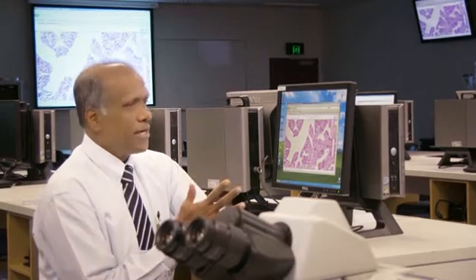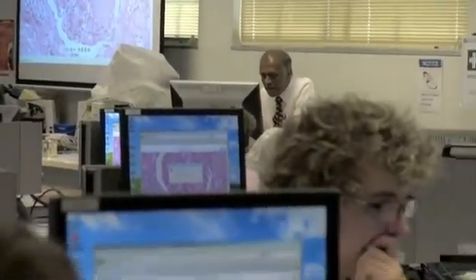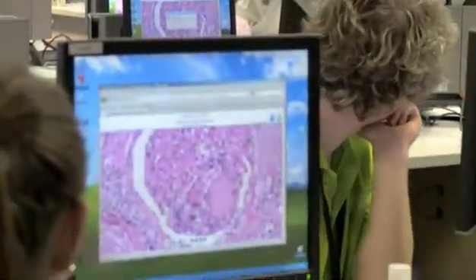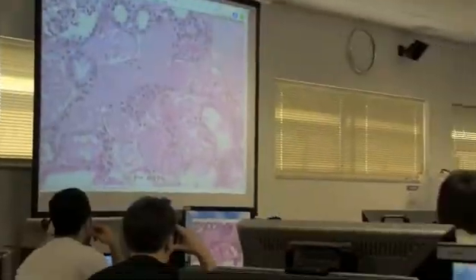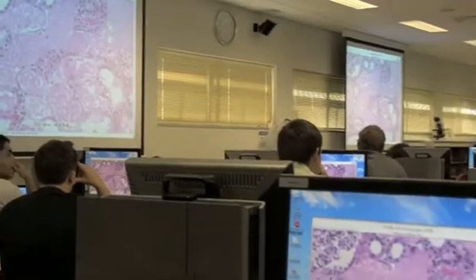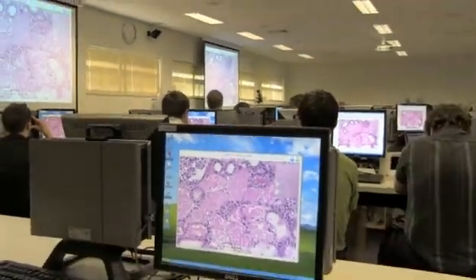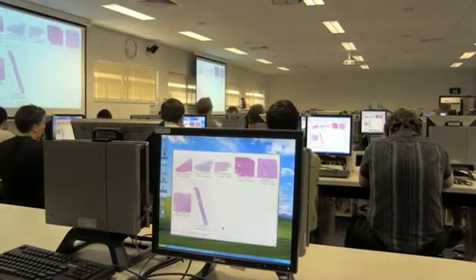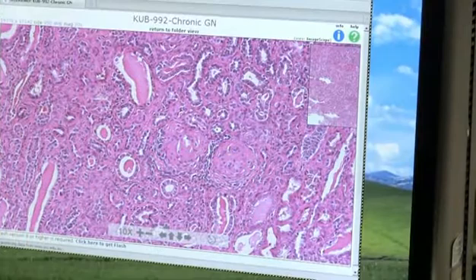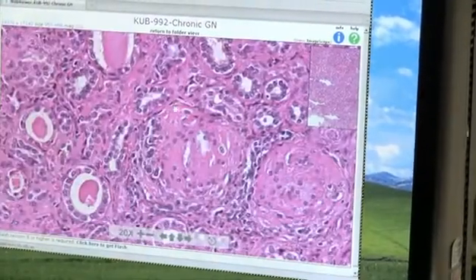Essentially what it does is the main computer shows the screen and all the computers duplicate that screen. When I am describing microscopy — a digital microscopy slide on the main computer — everybody is seeing the same microscopic field. I can zoom in, zoom out, move the slide, show all the features, and explain them to the students.